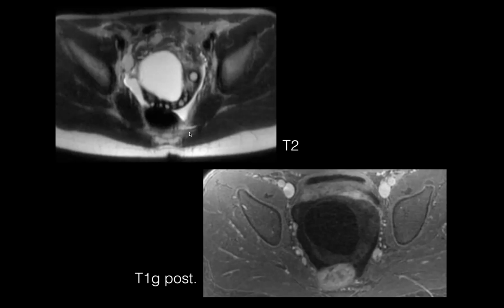So this is what's called ovarian torsion, right? The ovaries come off each side of the uterus, and there's a ligament, the broad ligament, that connects them to the uterus. If that twists, then it cuts off the blood supply and the ovary gets swollen, right? And eventually, if there's no blood flowing in, it will actually die. So if you can diagnose this in time, then you can go in operatively and detwist it. This case, though, I don't think is going to be salvageable.